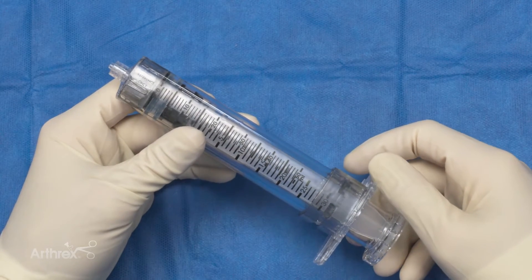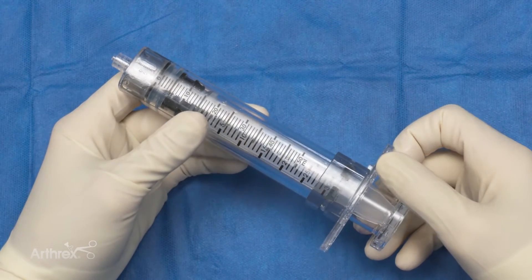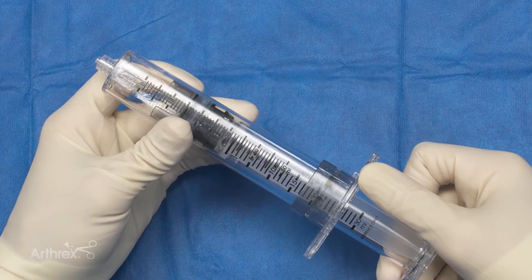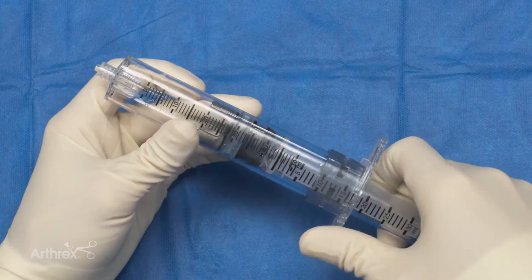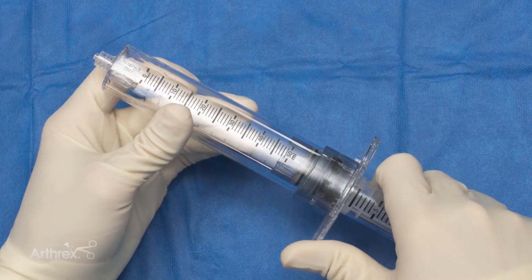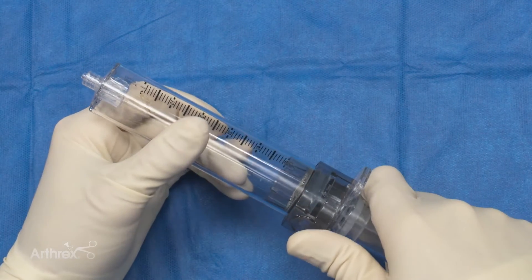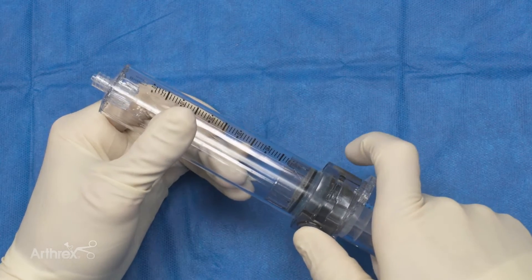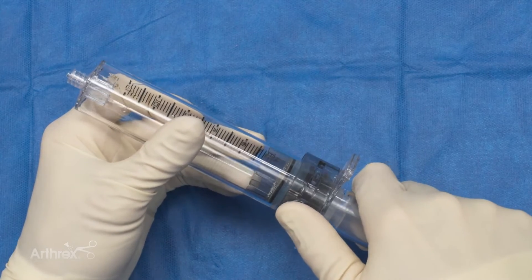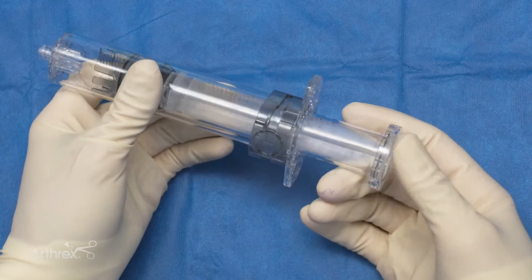Here is a close-up of the adipose restore syringe with a couple features to take note of. It is a double syringe system — we've got the first syringe that we're going to perform our lipo aspirate with. We're going to pull it all the way back until the device locks in place and you hear that little snap. You can unlock it simply by pressing there, and then the inner syringe is what we're going to push down — that's going to filter it through the 800 micron filter.